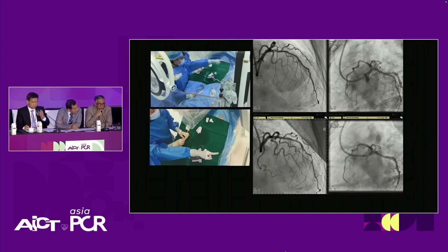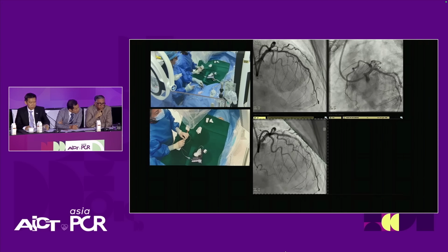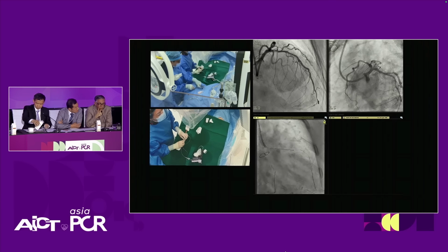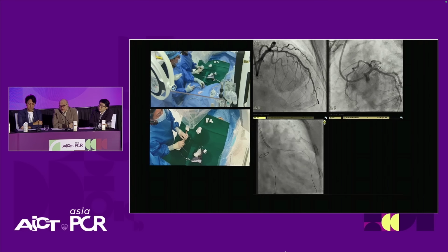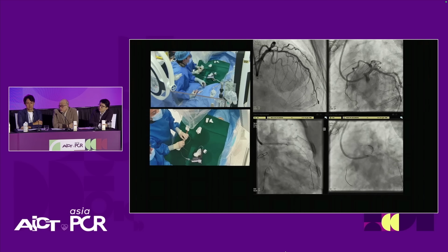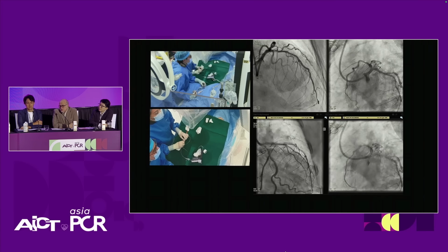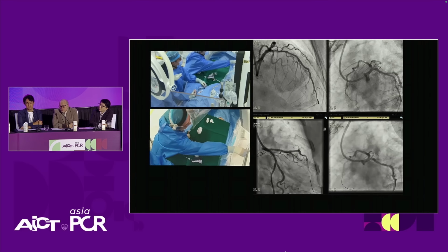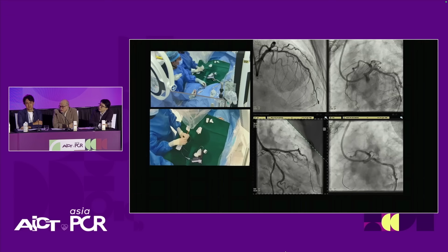But Imran, there are some situations where you need to stent bail out, right? What kind of situation would you bail out? If the dissection is more than type B, so C to F, flow is down, ECG changes, chest pain, and residual disease, immediate recoil, residual more than 30%, I'll probably stent. In this specific case we're in the proximal zone, so stents will be fine if needed for bailout. The problem is the distal disease, like small vessels, where you probably prepare longer. But in this case, I think it's fine.